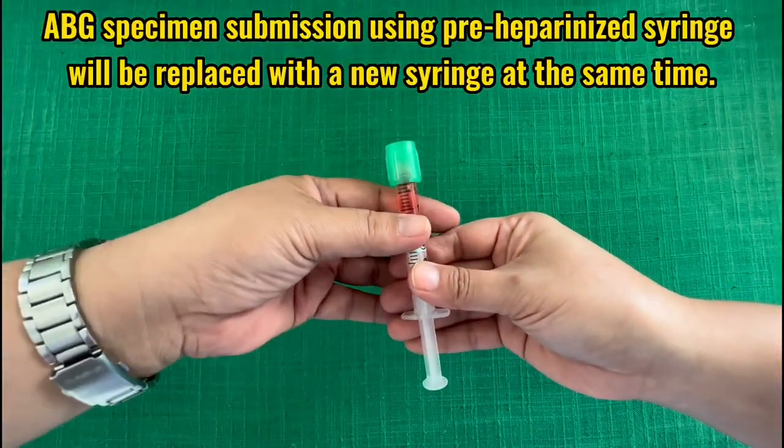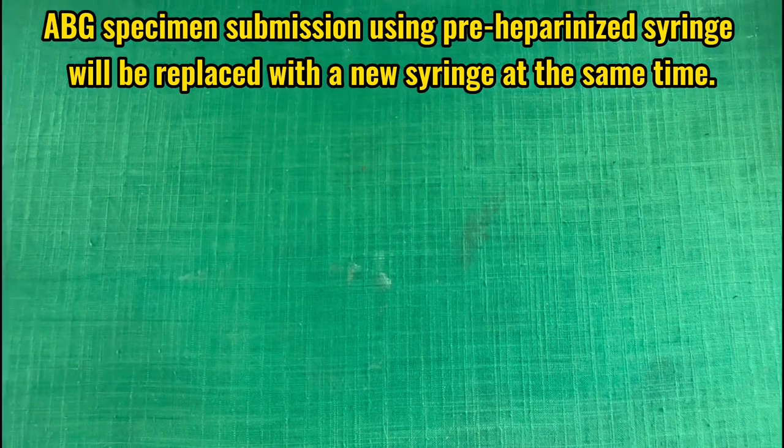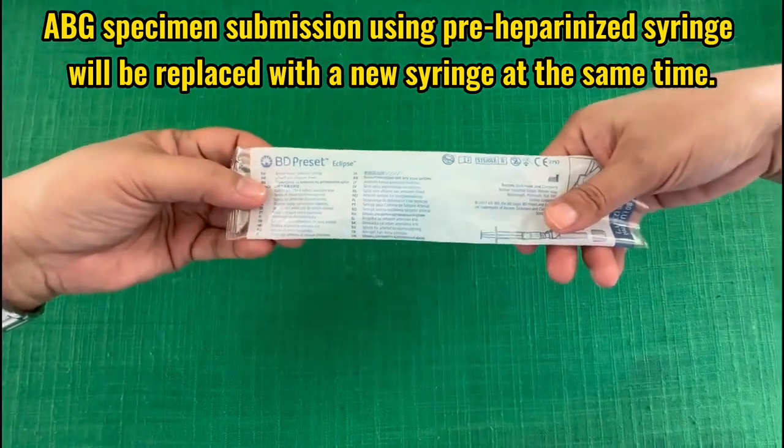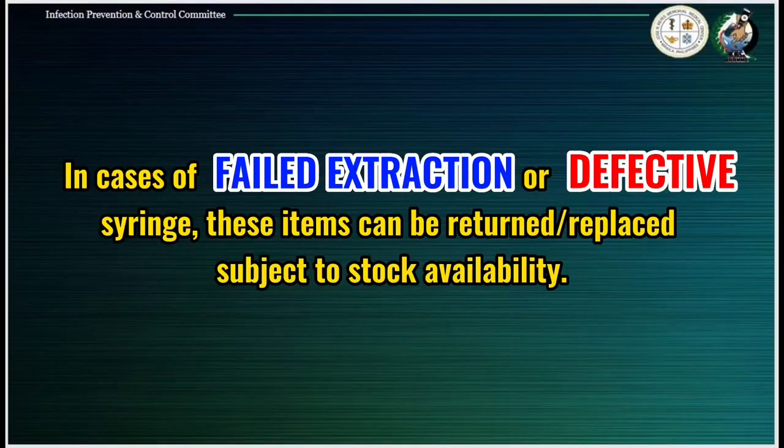For every ABG sample submitted by the clinical area to the laboratory department, the used pre-heparinized syringe will be replaced with a new syringe at the same time. In cases of failed extraction or defective syringe, these items can be returned or replaced subject to stock availability.